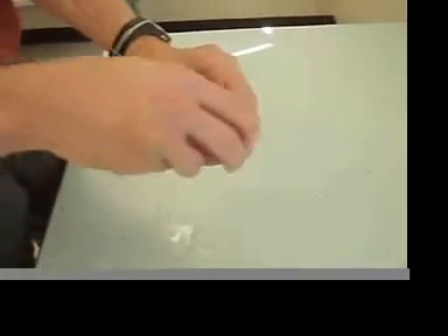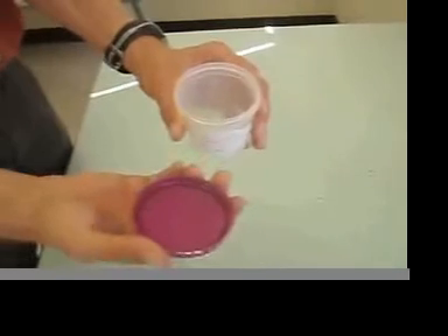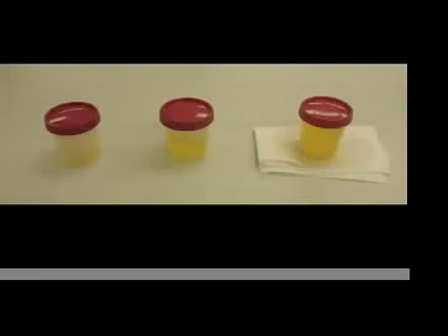Then you can unscrew the pink lid and now you're ready to collect. Please aim to fill your cup halfway full with urine.